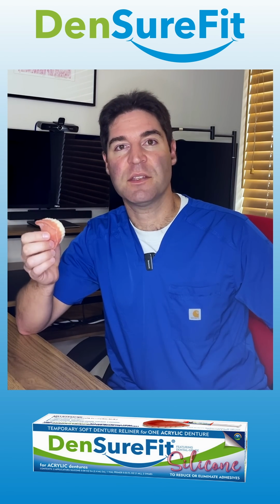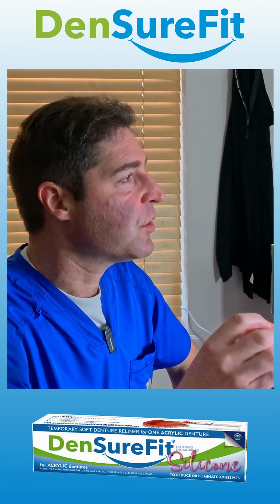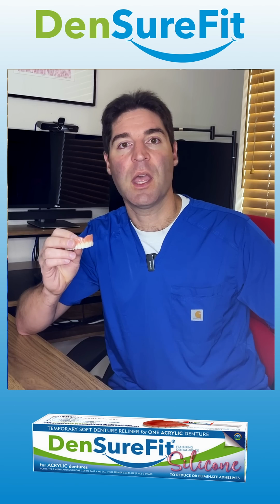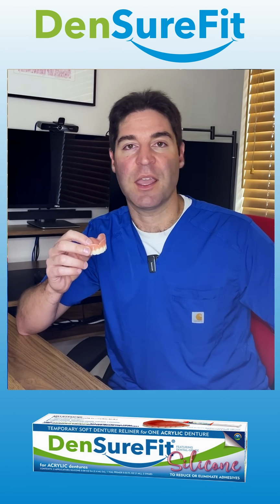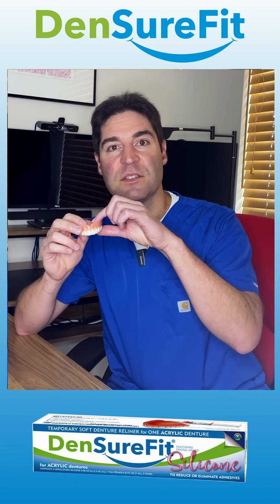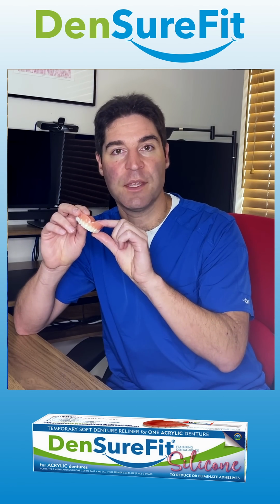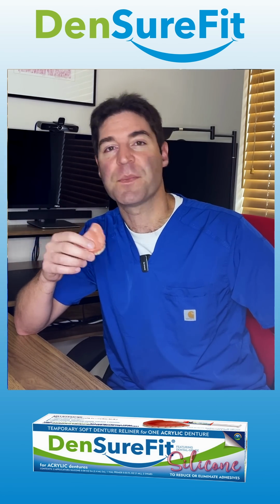The problem with adhesives is they can be very frustrating because as you're functioning, as you're chewing, as you're eating and drinking hot and cold liquids, the adhesives can melt and they can be washed out. And you can lose some adhesive on this side, and then all at once my denture is sagging, but it's still holding on this side. And then the other thing too, obviously, they don't taste very good.